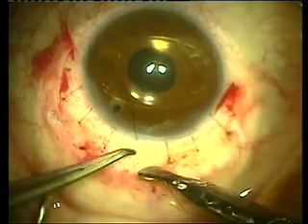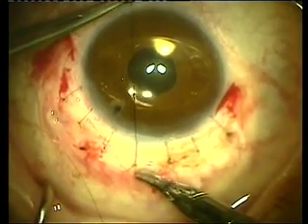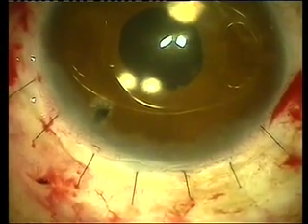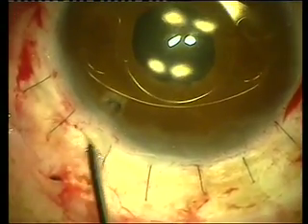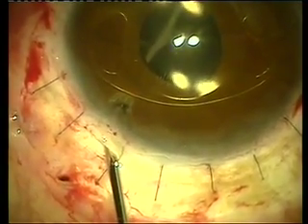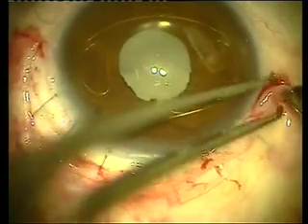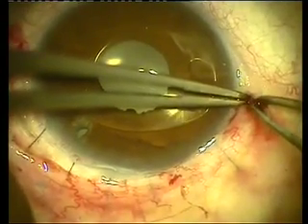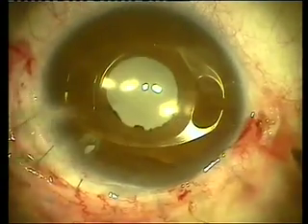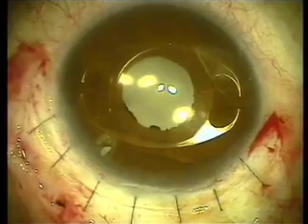The corneoscleral incision used for the removal of the cataract is completed here. As I mentioned previously, a total of seven sutures is used. We're placing intravitreal Kenalog here through the incision and through the iridectomy in order to avoid the chance of cystoid macular edema, and now with the cautery we are bringing back the conjunctiva and completing the procedure.